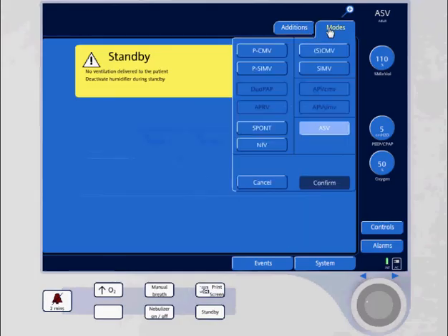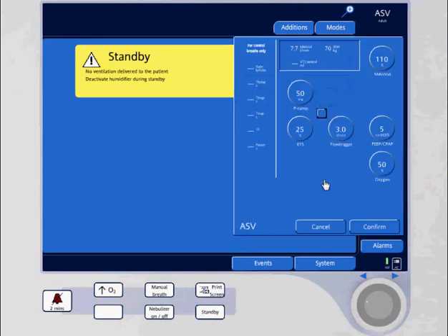I'm going to go ahead and go to modes. ASV is already selected, and I'm going to confirm it to get to my additional settings.